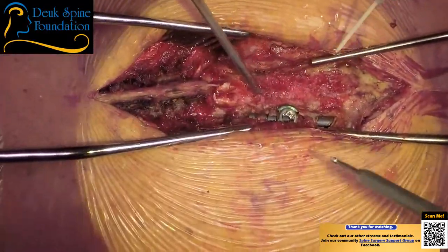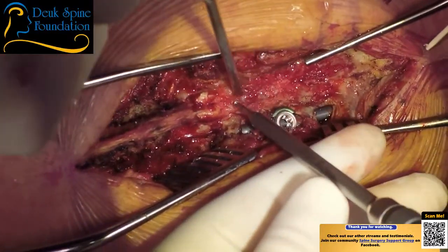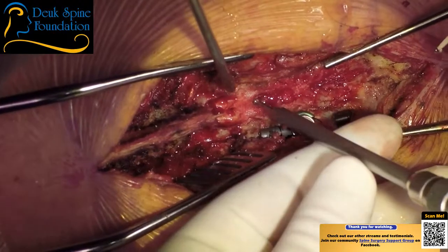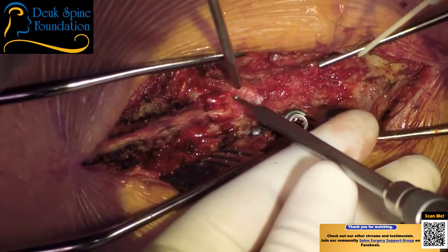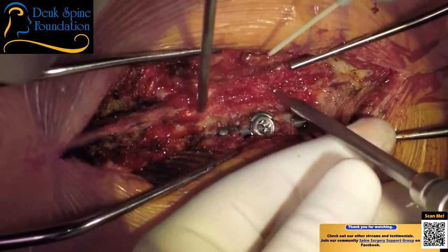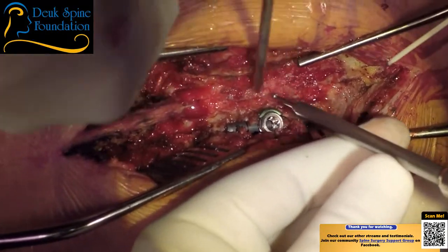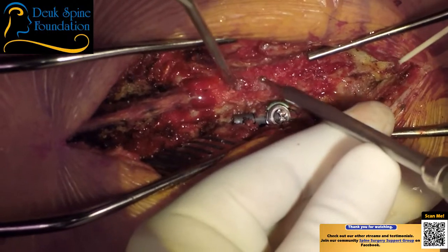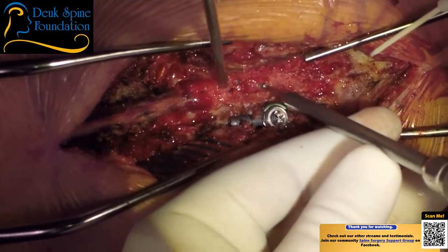That's what we talked about last week when I was talking about hemostasis or bleeding control. You gotta know where the bleeding comes from to be able to control it. If you don't know where the bleeding comes from, you're not gonna be able to control it. So there are epidural veins to bleed, there's the bone. I need you to suck the bone dust so I can see what I'm doing here. This is a lamina. And again, I'm keeping my laminectomy narrow. Suck.